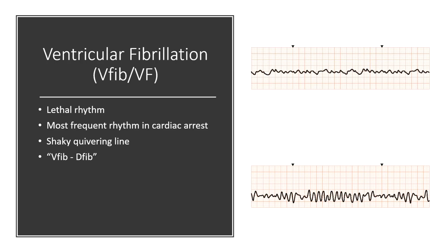Ventricular fibrillation, another lethal rhythm, most frequent rhythm in cardiac arrest, the shaking, quivering line. We don't have good perfusion. The causes are the same as VTAC. And then we want to defibrillate. Your patient should not have a pulse with this rhythm.